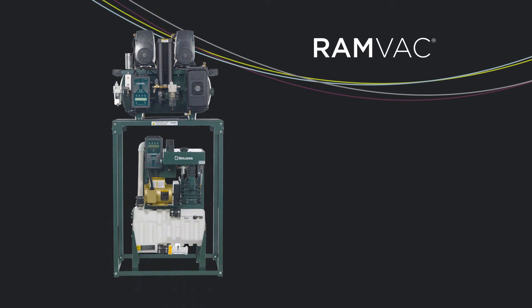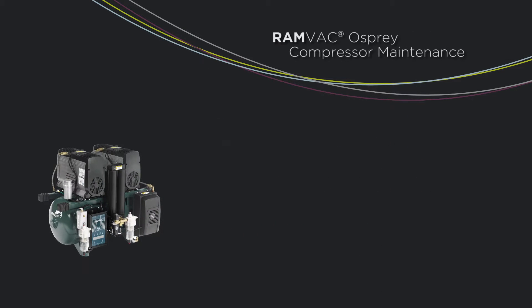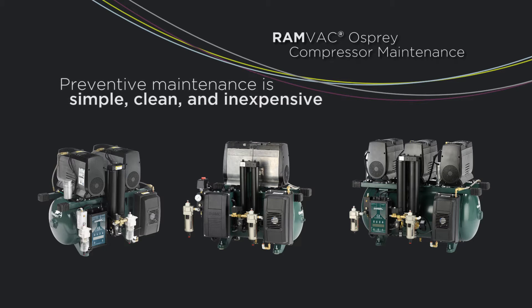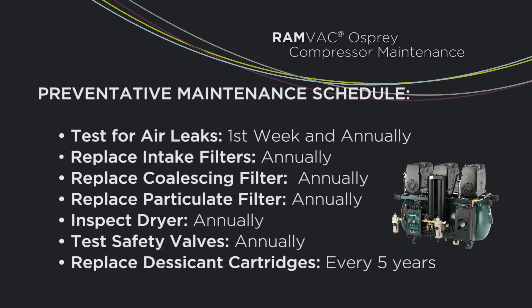RamVac builds a full spectrum of utility room equipment designed for maximum reliability for your practice. Osprey compressor preventative maintenance is simple, clean, and inexpensive. It can help ensure your system provides years of predictable performance. Follow this recommended schedule for a compressor in a clean, dry environment to avoid the need for more frequent maintenance.